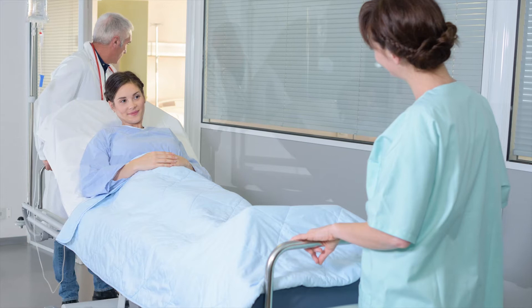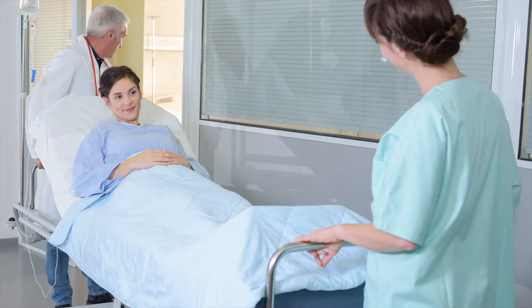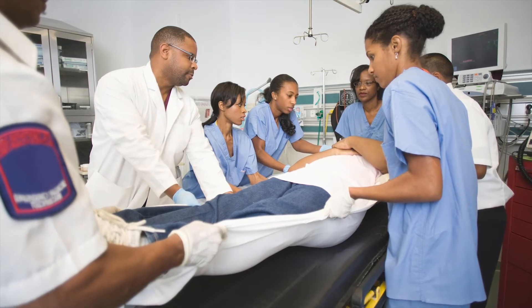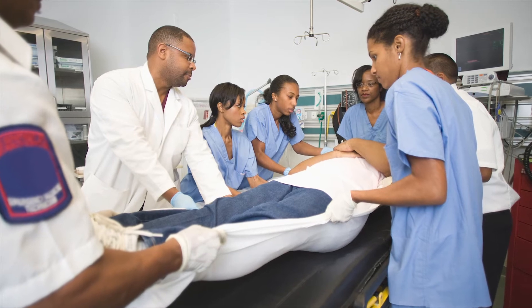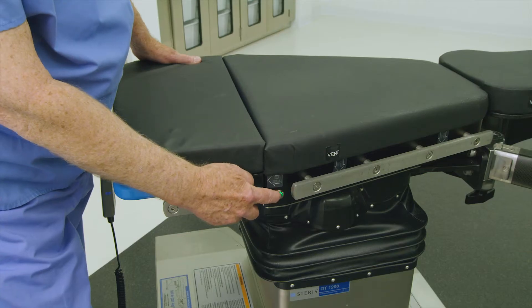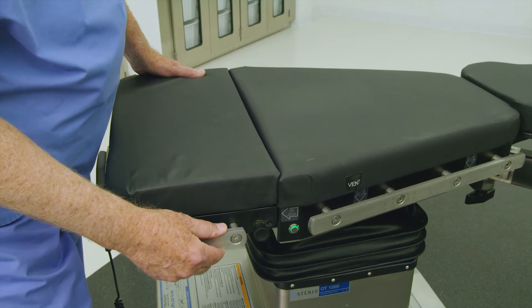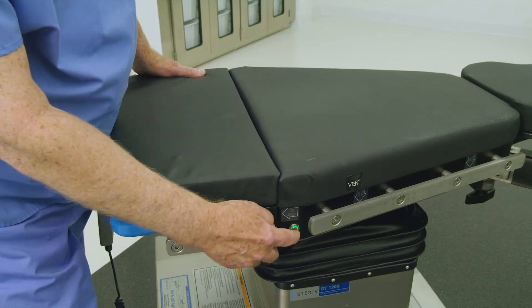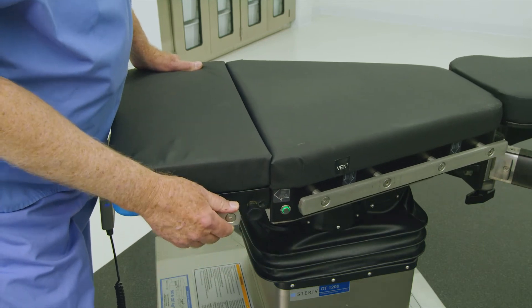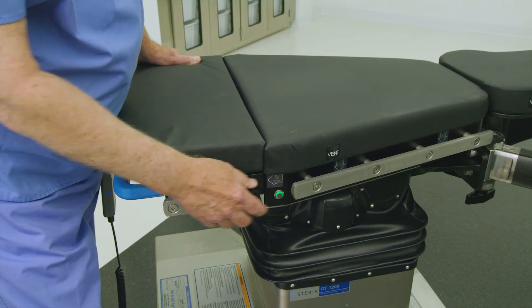Execute patient transfer using facility protocols for safe patient handling and ensure even patient weight distribution. Once the patient is positioned safely on the tabletop's surface, adjust the tabletop by repeating the instructions to obtain the desired lateral tabletop position.